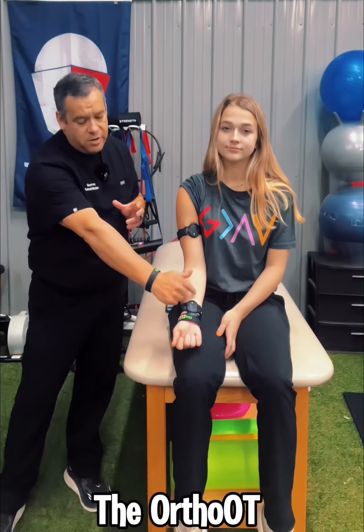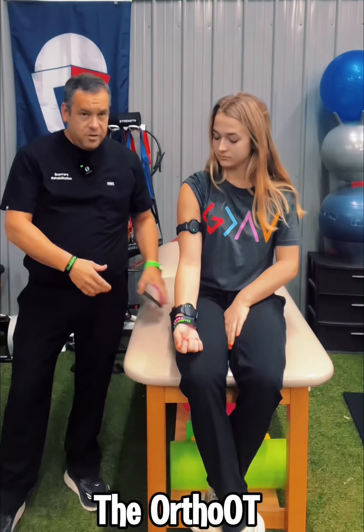What's up everyone? Here's another great application using the Pulse device. Kinsley has this here — I have it pretty much over the median nerve distribution running down through the arm and forearm. What we're going to work on right now is some kinesthetic awareness, whether she's had an injury or she just wants to improve her motor control and functional use of her upper extremity.